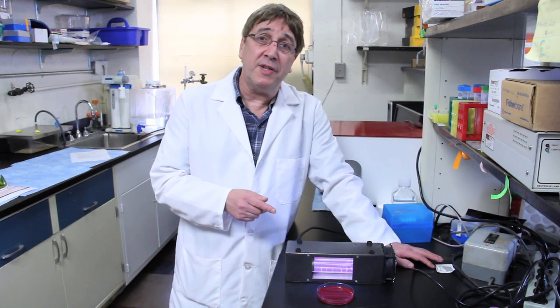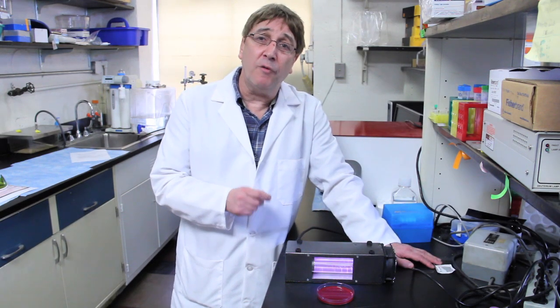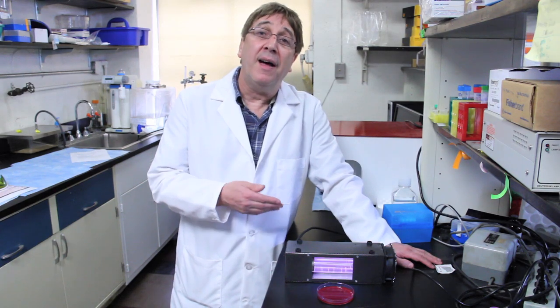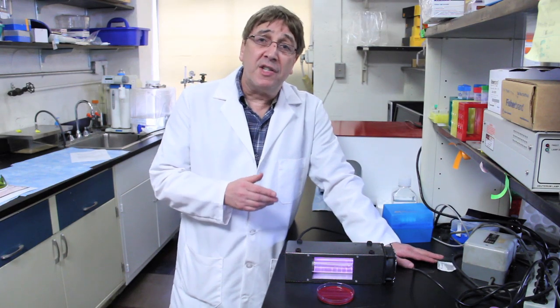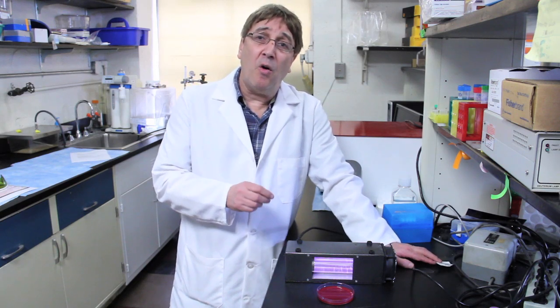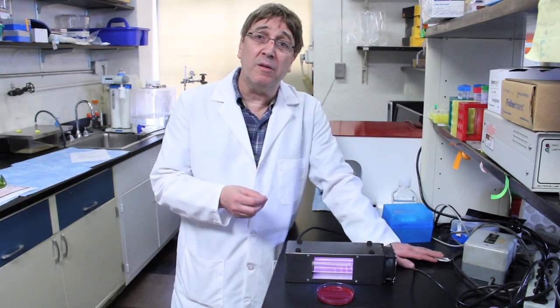This excimer lamp produces ultraviolet radiation of one particular wavelength, and that's about 207 nanometers. What's special about this particular wavelength is that while it kills bacteria very efficiently, it is very strongly absorbed in biological materials.